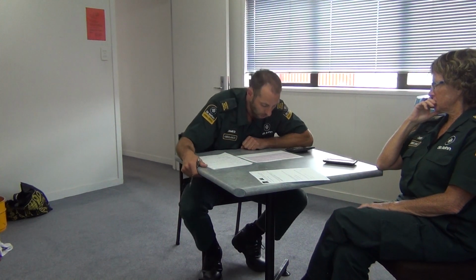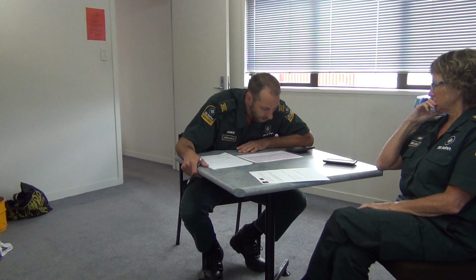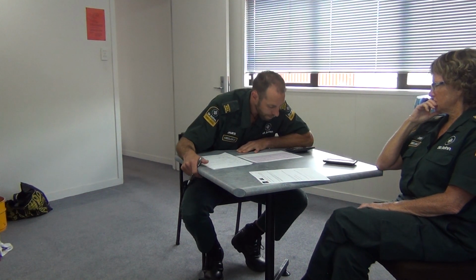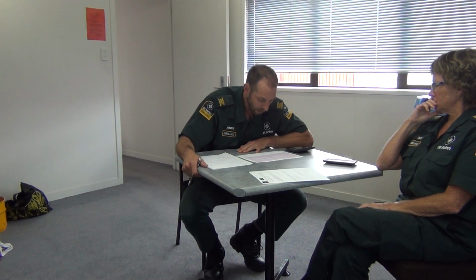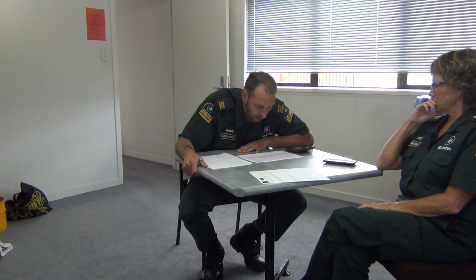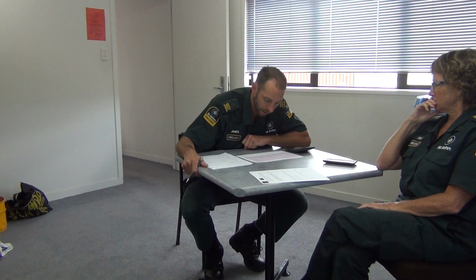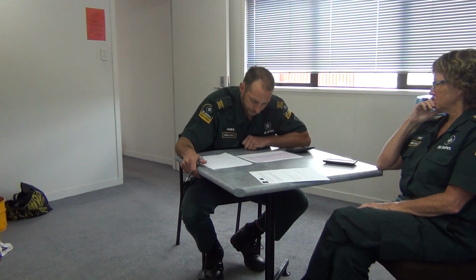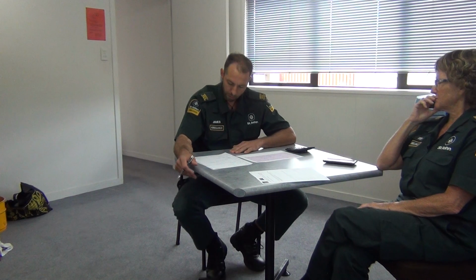Just looking at T waves, they all look normal in morphology. There's possibly a biphasic one in V1. Yeah, other than that, it's quite normal.